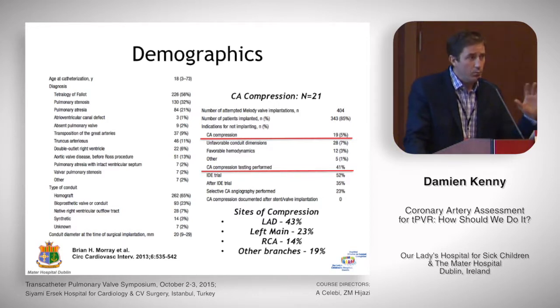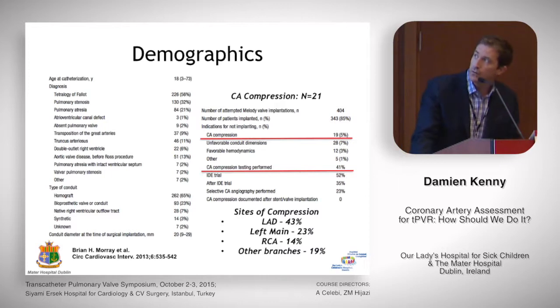And in fact, one of the things I'll talk about is the importance of pre-assessment. Actually, 4 of the patients had pre-existing coronary artery abnormalities before they ever balloon assessed the RVOT. So it's a really important thing to assess the coronaries with initial injection or with the CT scan that's been discussed this morning, before we get to the point whereby we make a decision on whether the coronaries are actually abnormal with the balloon inflated in the RVOT.